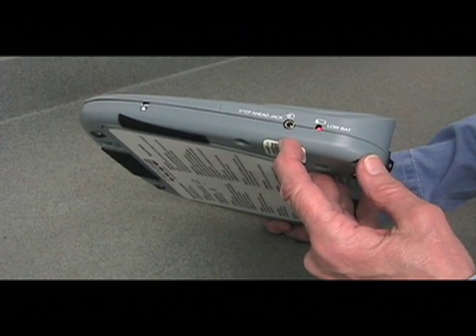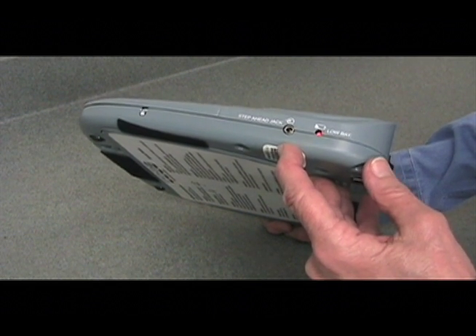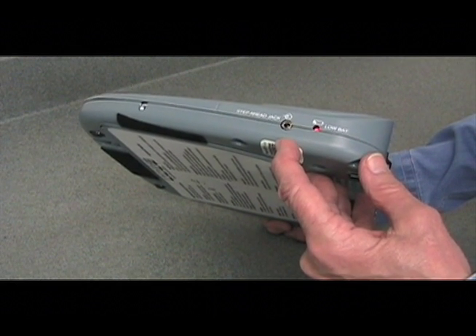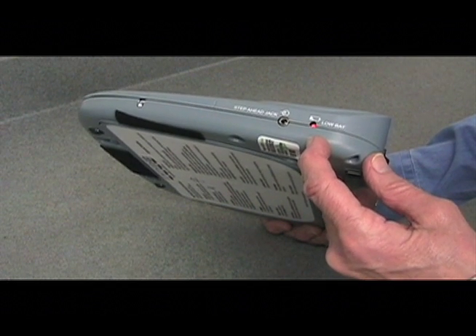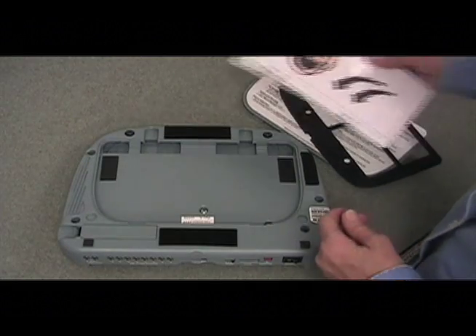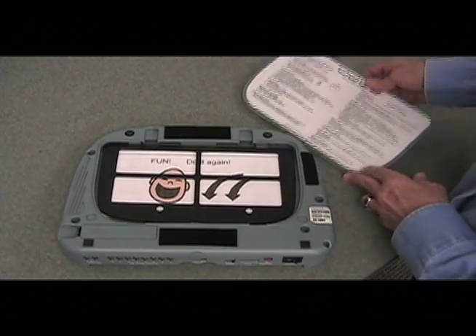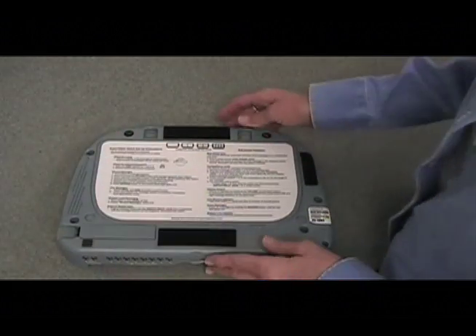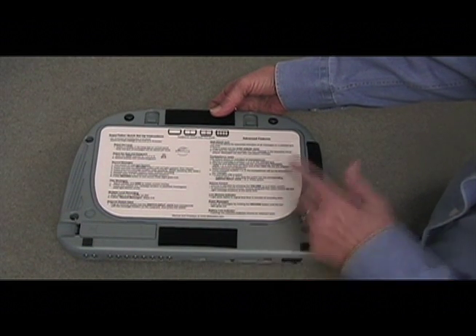On the right side of the device we have the step-ahead jack. By plugging a switch into this jack, the user can produce messages in sequence by repeatedly pushing the switch. And we have the low battery light, which flashes when your batteries are running out of power. The bottom of the device is pretty convenient for storing overlays and grids that you're not using. And when the cover is in place, you also have instructions for recording devices and using the various controls.